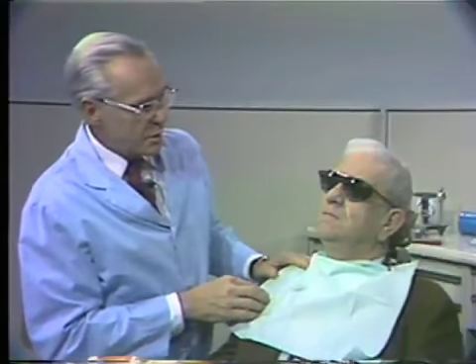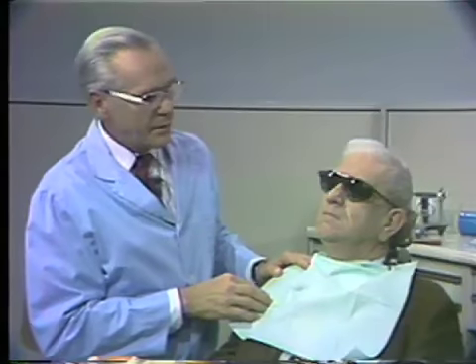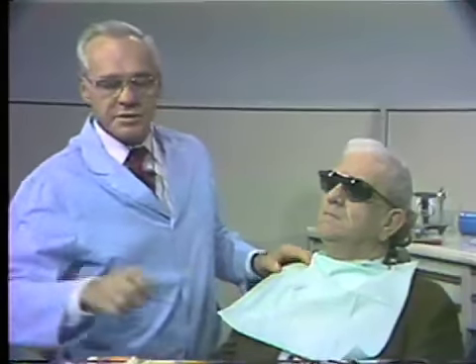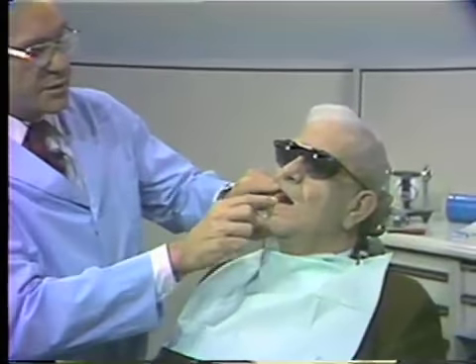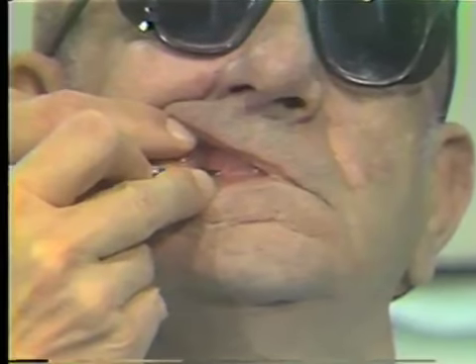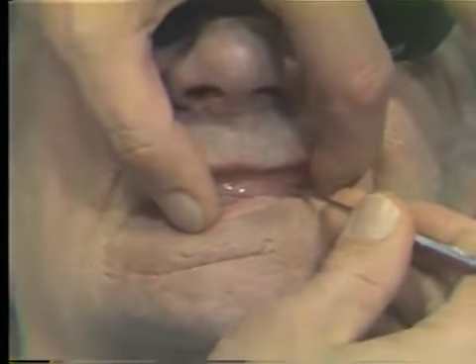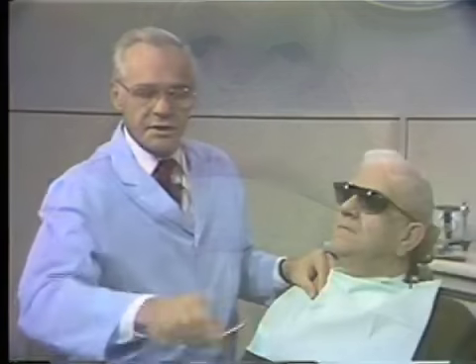Our next step now will be to record the centric relationship. We will do this by the use of a soft wax and some grooves on the opposing rim. For this purpose, we'll have this close together, Mr. Monahan, and we'll make a little mark right at the cuspid region on either side of this maxillary rim. Now, the anterior portion will maintain our vertical dimension of occlusion. The posterior portion we will take out of occlusion and substitute a soft wax for the pink wax.